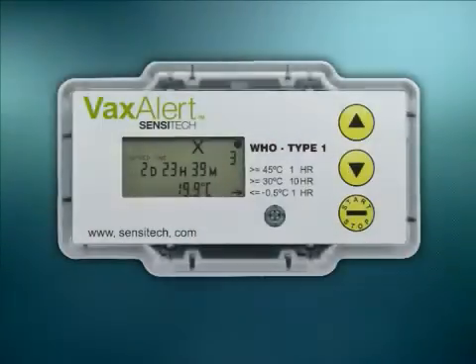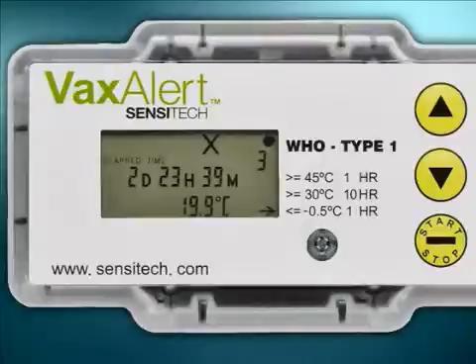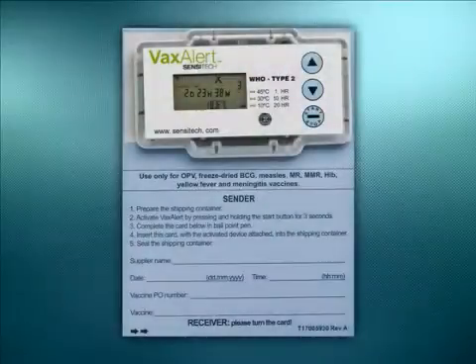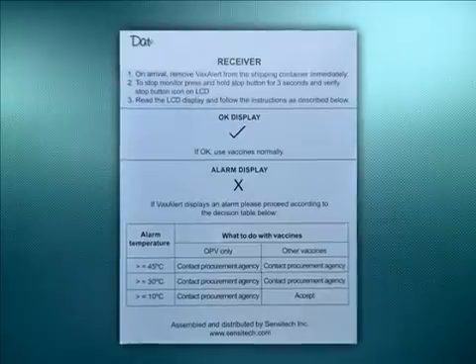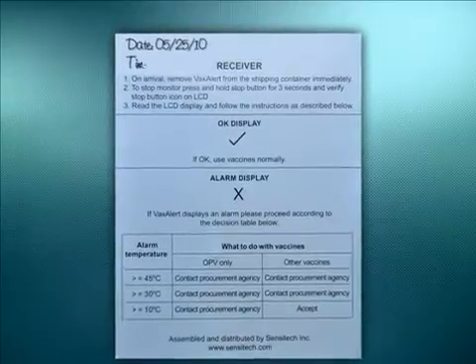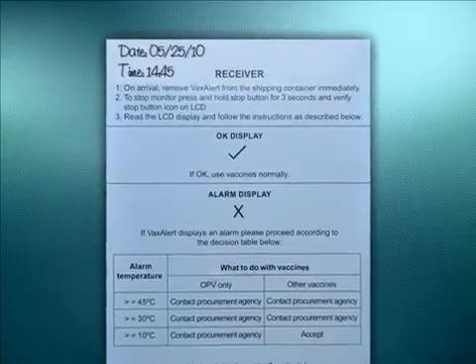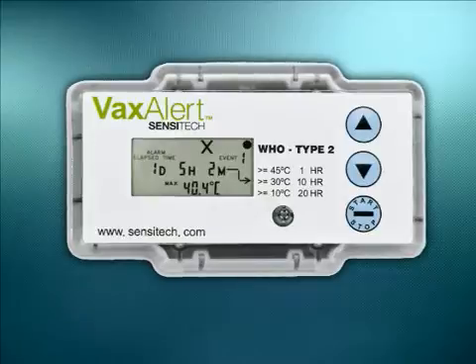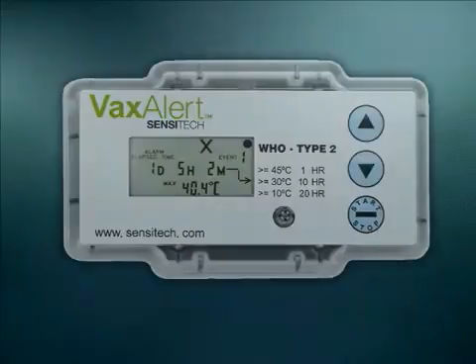If any of the set time temperature alarm limits are violated, an alarm indication will be displayed as an X in the middle of the screen, above the total elapsed time display. If there are any alarms as indicated by the X sign, you must write down the date and the local time you stopped the device on the receiver side of the backing card. This is important when you refer to the device after you have stopped it. In history mode, the Vaxalert presents additional information which explains when alarms have occurred and the type of violations committed.